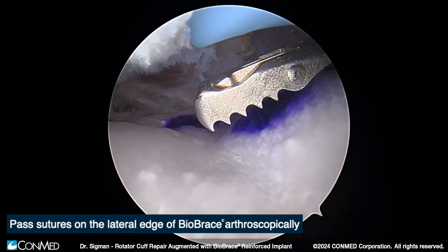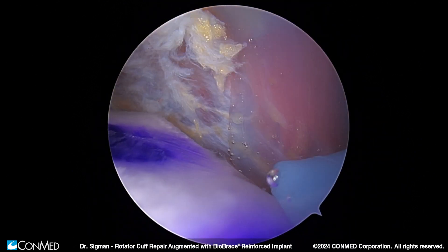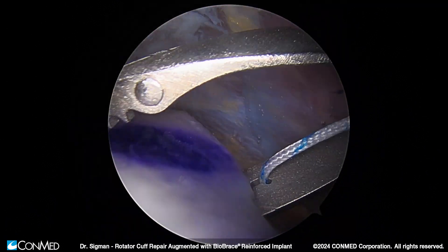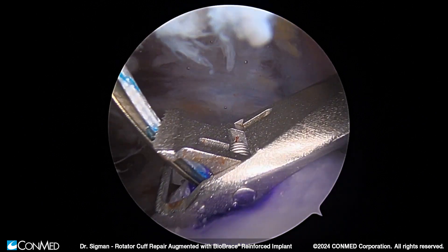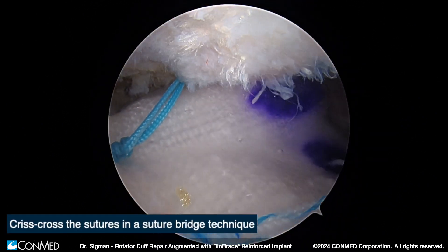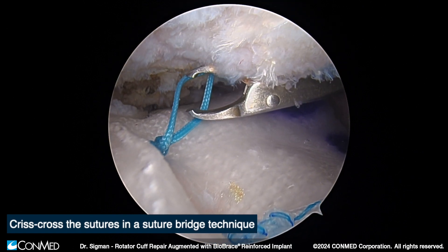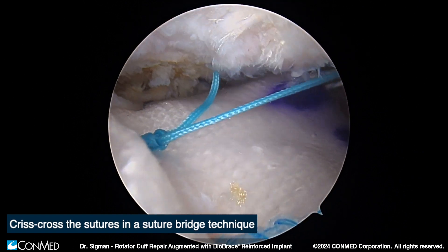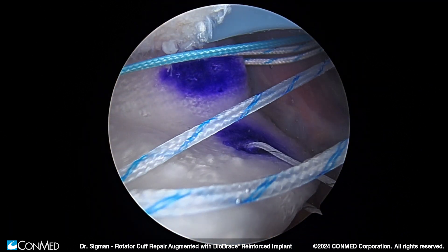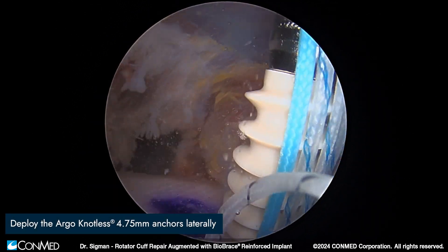We like to pass lateral sutures here as well. These are tensioning sutures which allow us to ensure appropriate tension on the suture for our lateral aspect repair. We mark these with purple spots so we can easily identify where we want to place our graft. You can see the suture passer works beautifully through this graft without creating an issue.